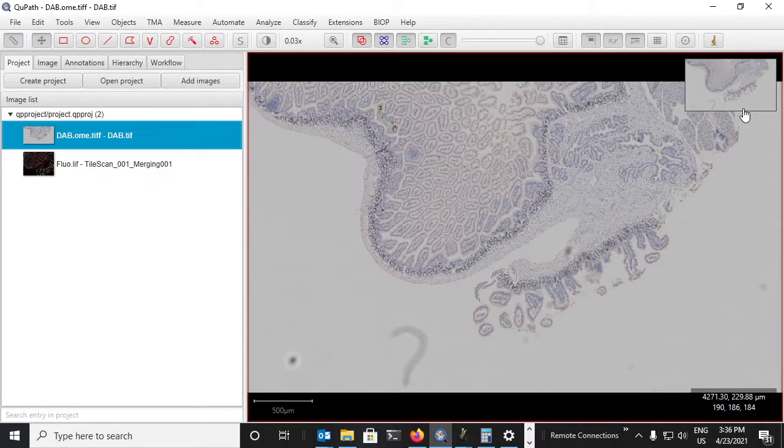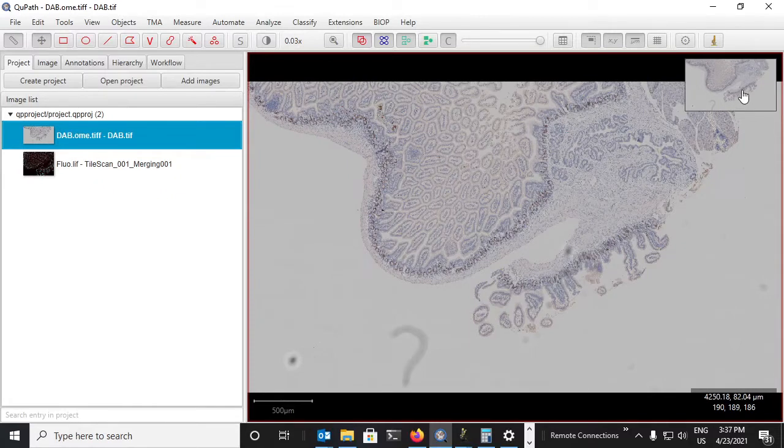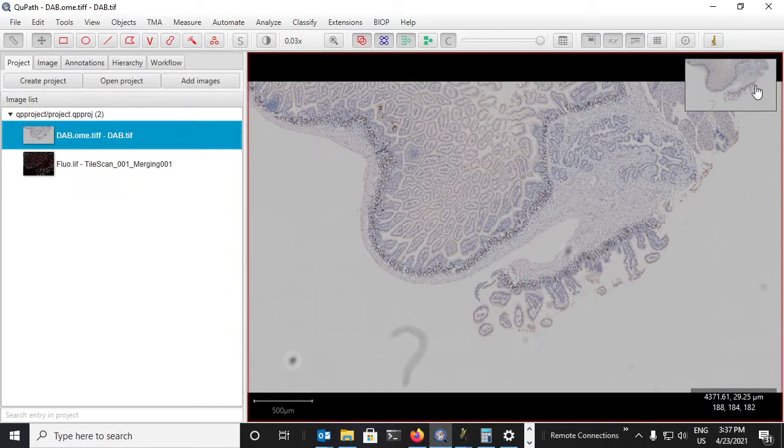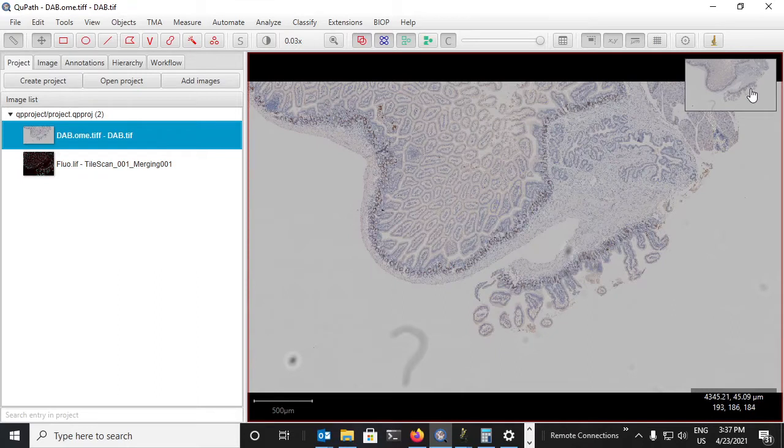Hello everyone and welcome back to the third video on whole slide image registration. At the end of the previous video, we ended up with a registered transformation that registered the DAB image to the fluorescent image.